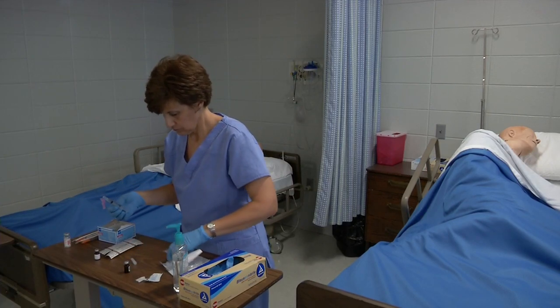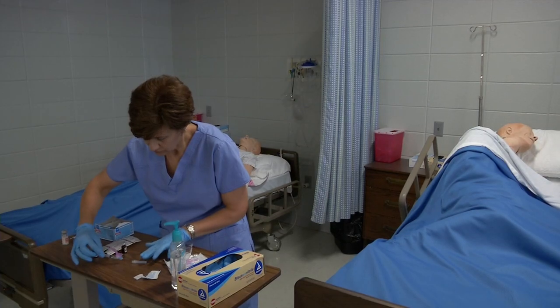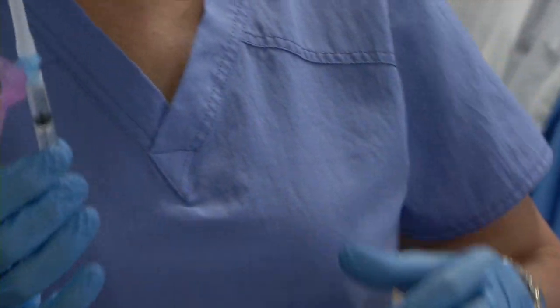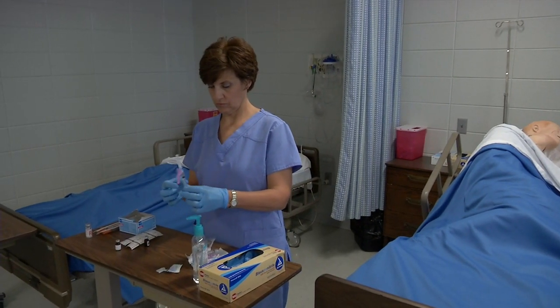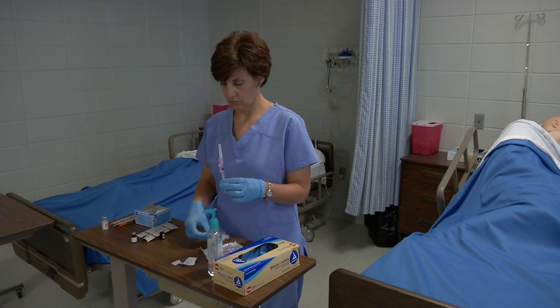You will recap the needle with a scoop method. If you draw up this medicine other than in the patient's room, you must label it.